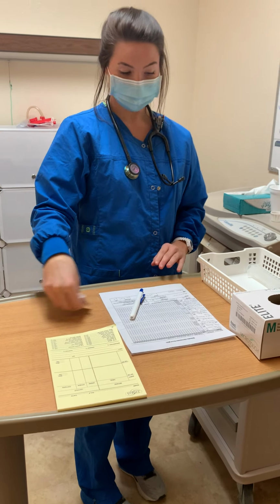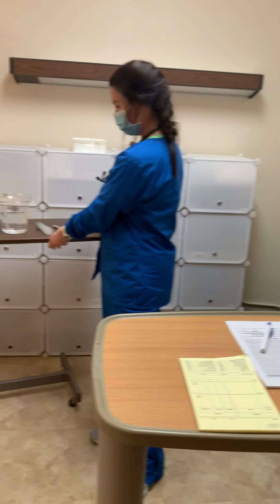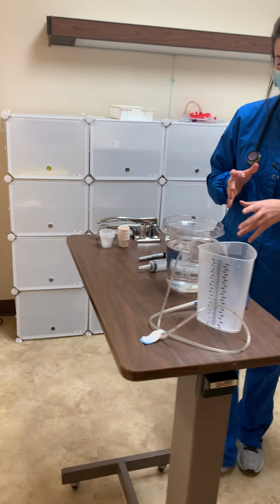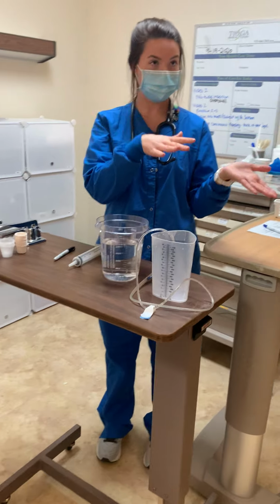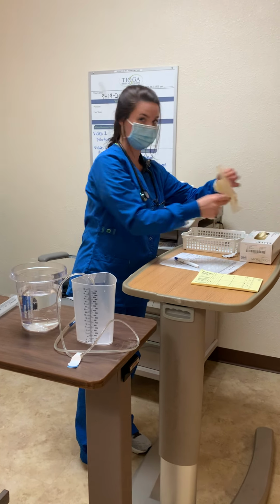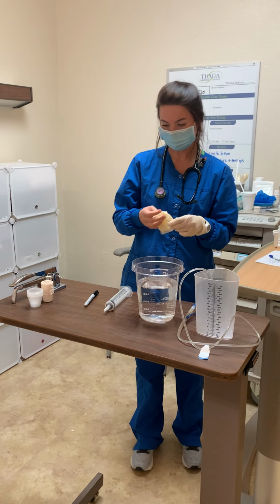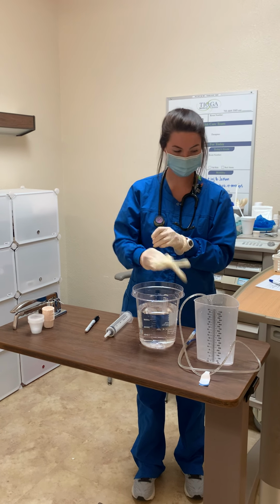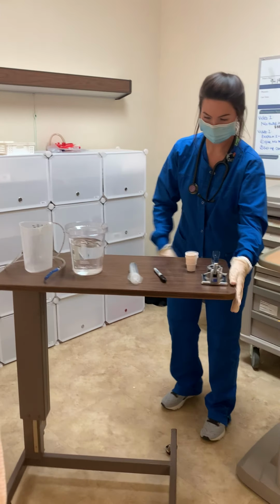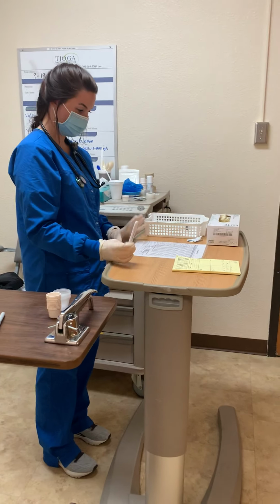And then now I'm going to be mixing her medications. And because we can't put any liquid into Joanne, we're going to be doing it into these for video purposes. So I would do my hand hygiene again, get off my gloves here. I'm just going to flip my table around. Okay, so I'm in my med room here, and that's just where I'm going to get my medications ready.